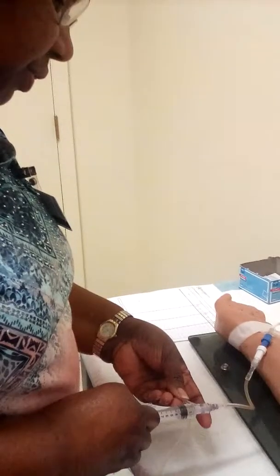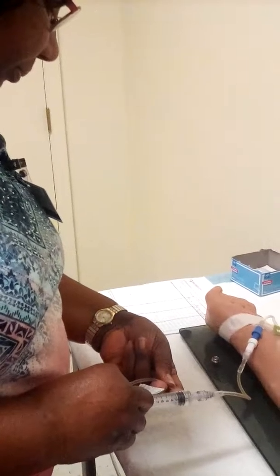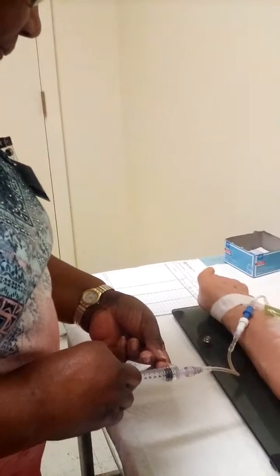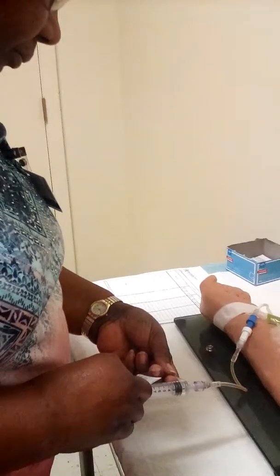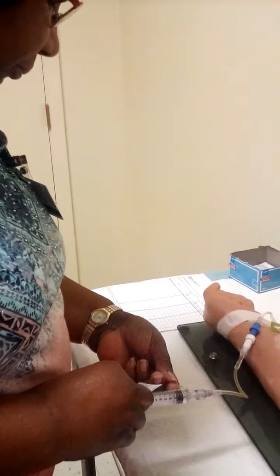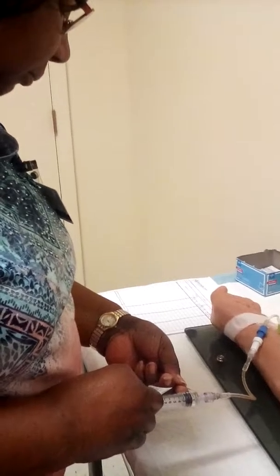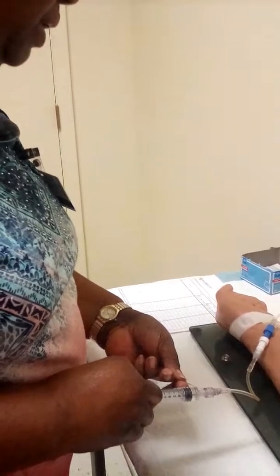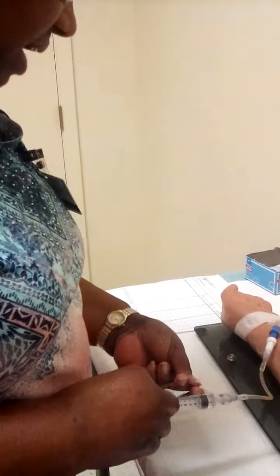I'm gonna push and pause. Making sure that the patient is tolerating the procedure okay, not having any puffiness or swelling at the IV site.